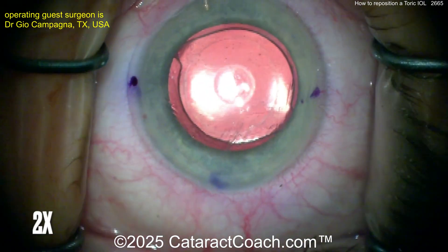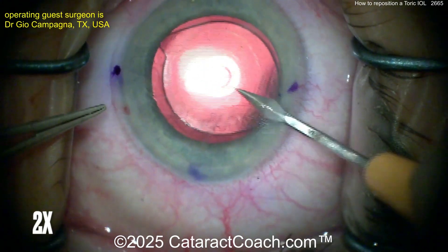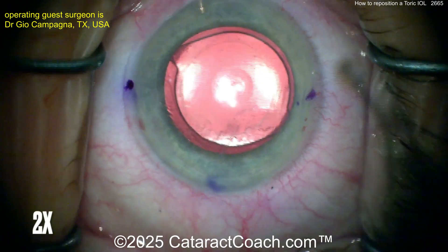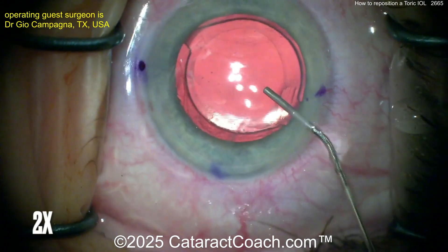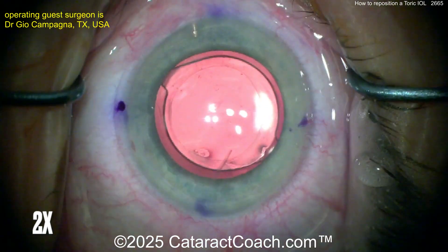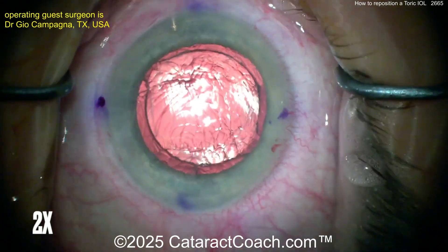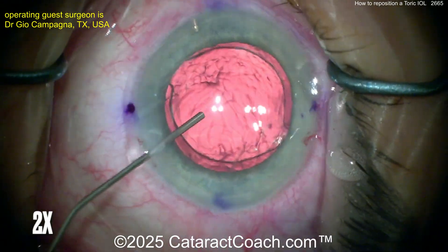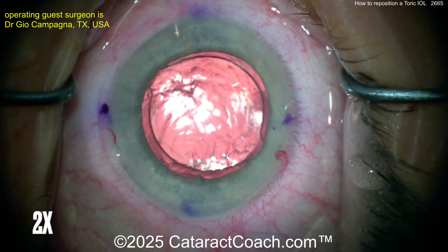You can open up the existing incisions. Not sure when this patient had prior cataract surgery, but you can see this toric lens that's in the bag — looks like an EDOF lens — is not at the appropriate axis. As a result, the patient doesn't have a good refractive outcome. Remember, for every 30 degrees or one clock hour that the lens is off, you basically lose all benefit of the toricity. In this case it looks like it's off by about 30 degrees, so you definitely want to get it rotated back appropriately.